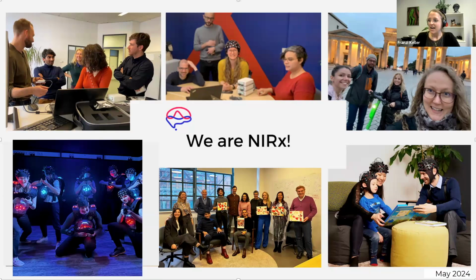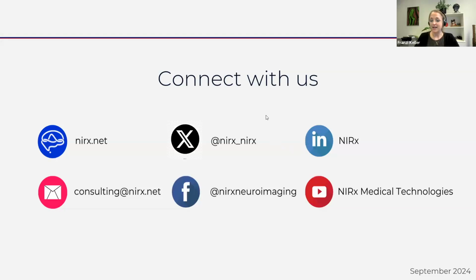And it is our goal to make publishing as easy as possible for you, and very fittingly, today's webinar falls right along those lines because we do believe that the NIRx integration with ePrime will make your experiments even more smooth.